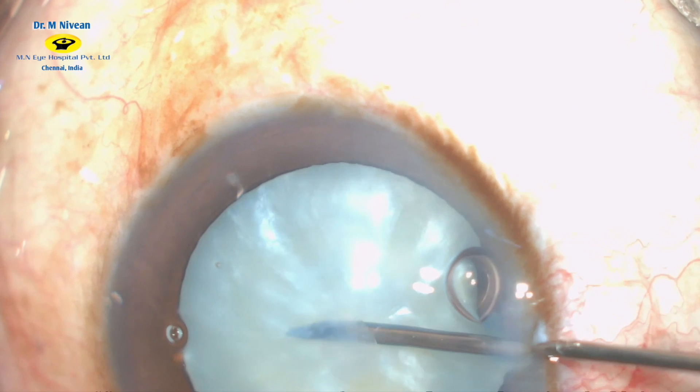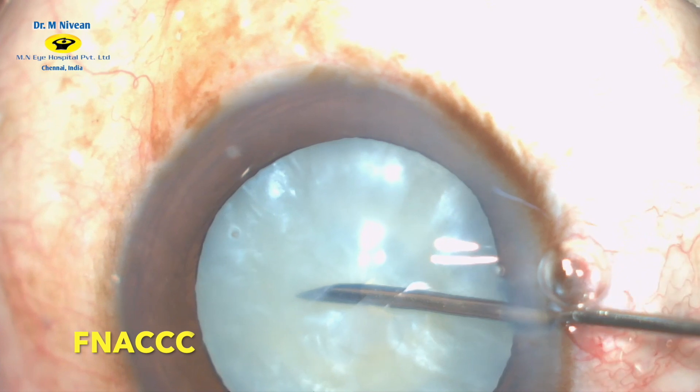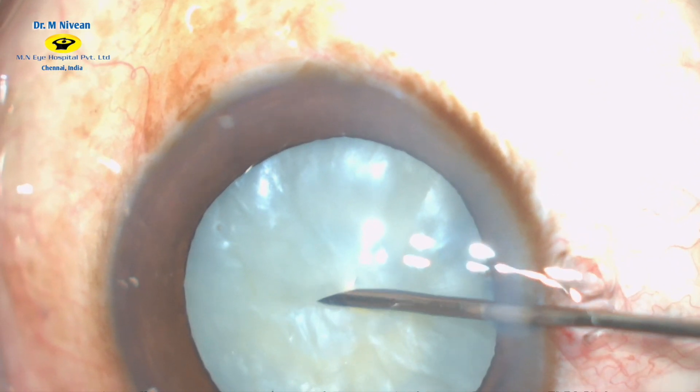Using a 23-gauge needle, a small puncture is made in the center of the anterior capsule and the liquefied cortex is aspirated.